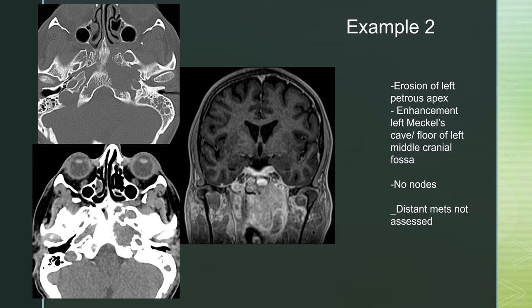Example two: on bone windows, you see a soft tissue mass eroding the left petrous apex and the lateral aspect of the clivus at the expected location of the petroclival ligament. Here it is on soft tissue windows — you can see the soft tissue with that bony erosion.